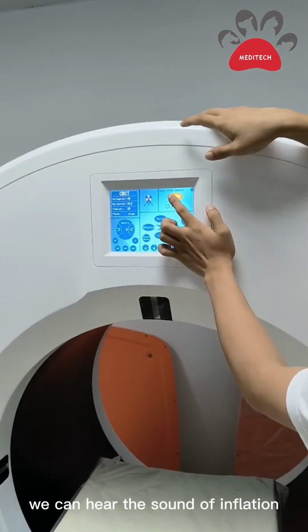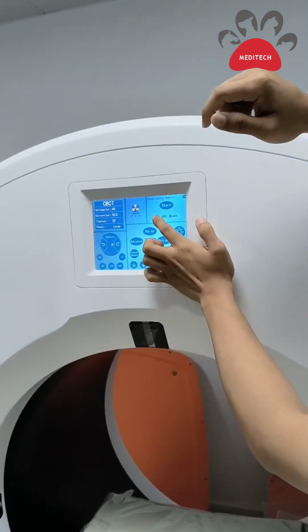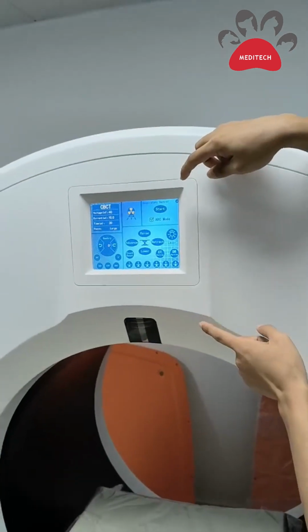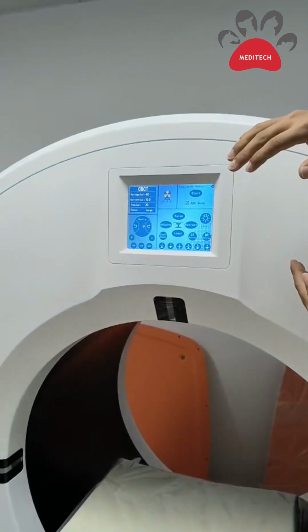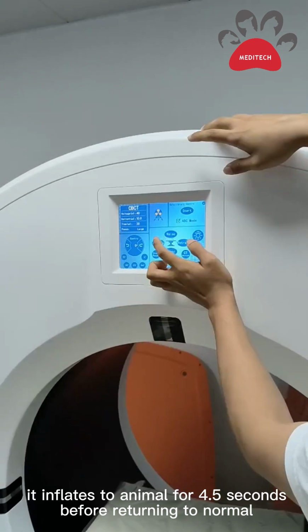We can hear the sound of inflation and the ABC mode. When the animal is undergoing CT scanning, it inflates the animal for 4.5 seconds before returning to normal.